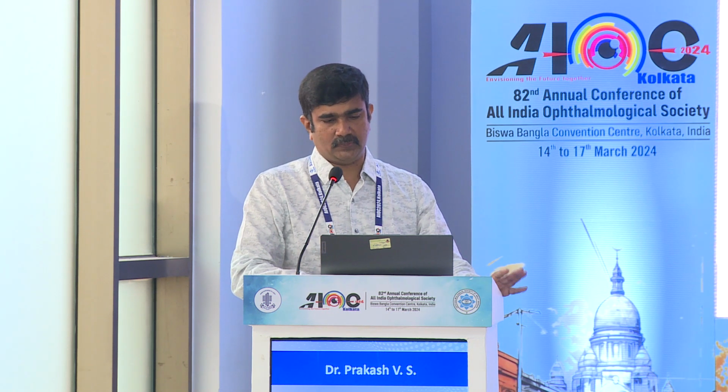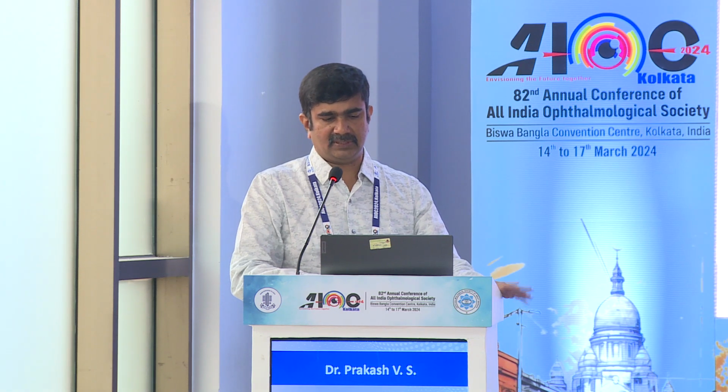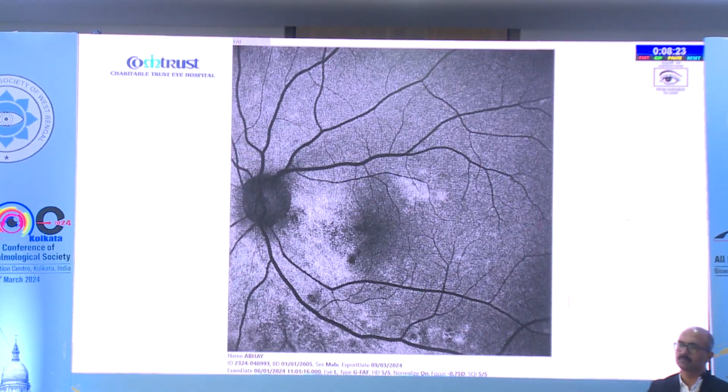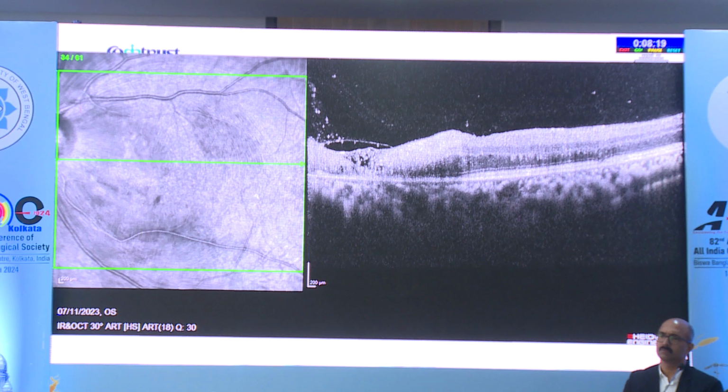In the Widefield photo, there are some artifacts, but there is no other lesion in the periphery; only that posterior pole lesion between the disc and macula is seen. And an FAF picture clearly shows granular hyperfluorescence between the disc and macula, and blocked fluorescence due to the hemorrhage, corresponding to the hemorrhages on the retina.